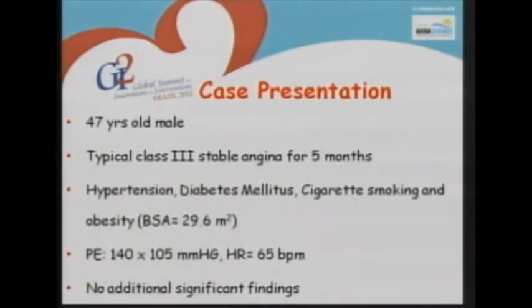Okay, this is the case of a 47-year-old male patient. It's important to stress it's a very young patient, 47, that came to our service. His physician referred to us. This patient had a typical class 3 stable angina for the past 5 months.